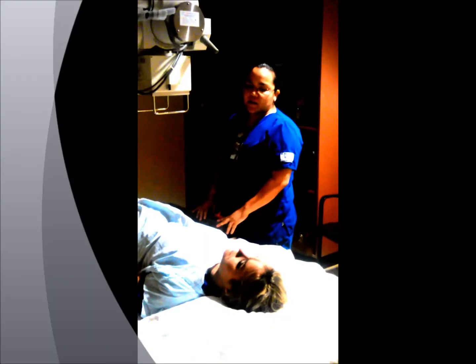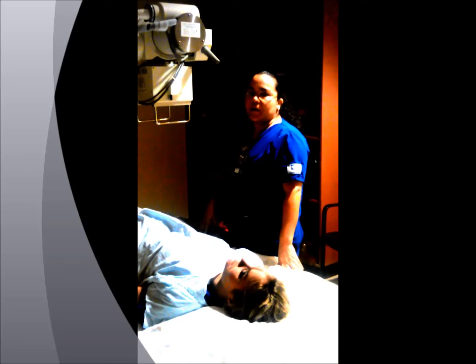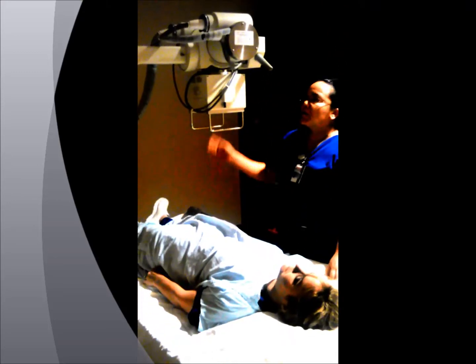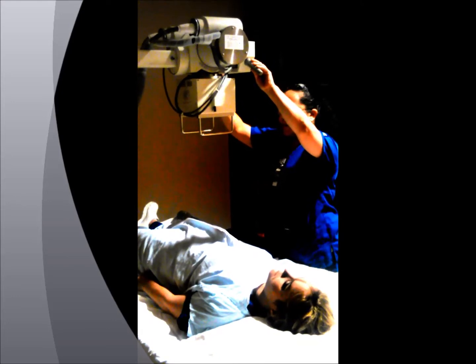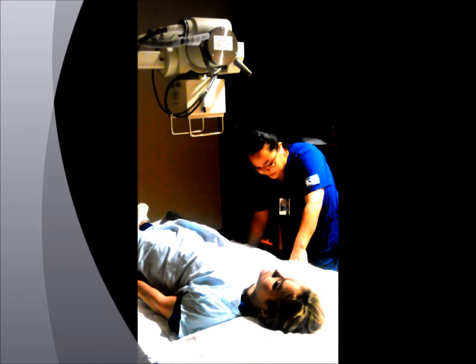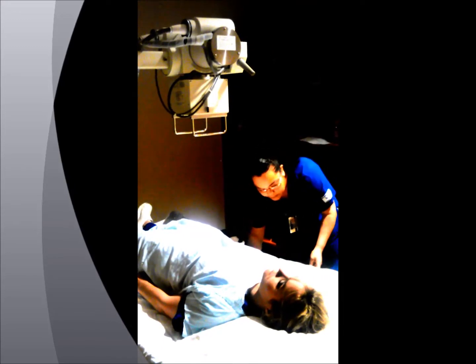Okay, I will be demonstrating the posterior obliques for the L spine. The pathology would indicate any defects to the pars articularis. So you want to have your patient in the supine position and make sure that the tube is at 40 inches from the bucky. The cassette, you can use a 10 by 12 or 11 by 14.